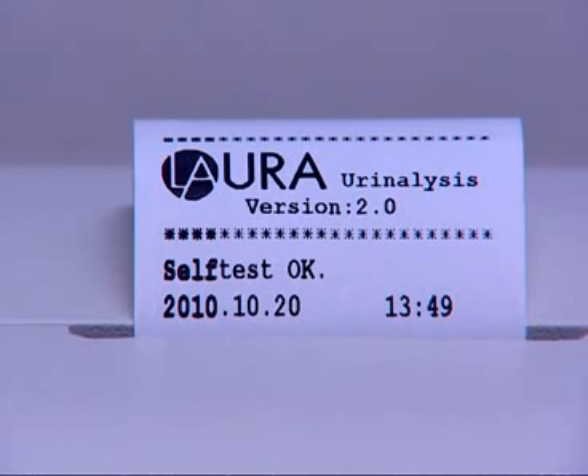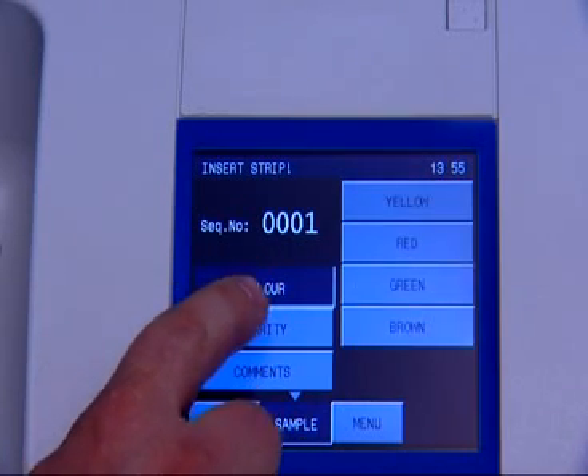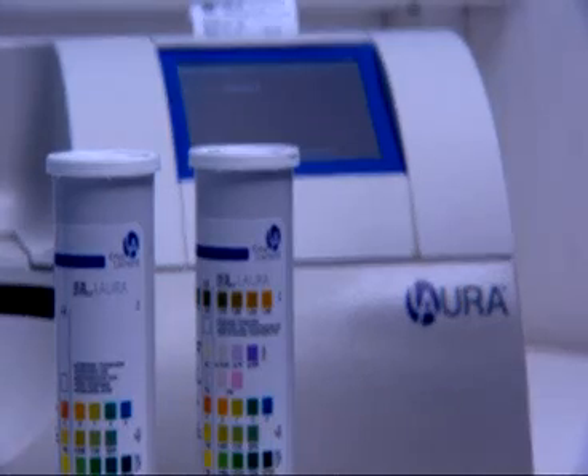The LAURA reader is a semi-quantitative, semi-automatic solution for the analysis of urine in your lab. Its rich user interface allows for maximum adjustment to the individual requirements of urine analysis in the laboratory.